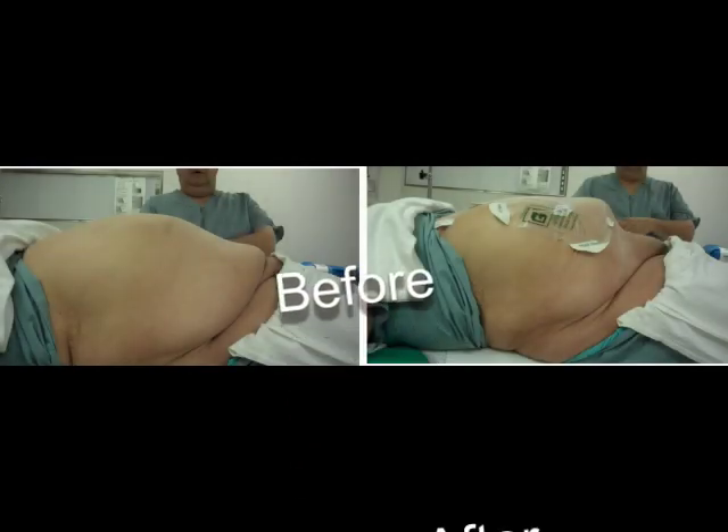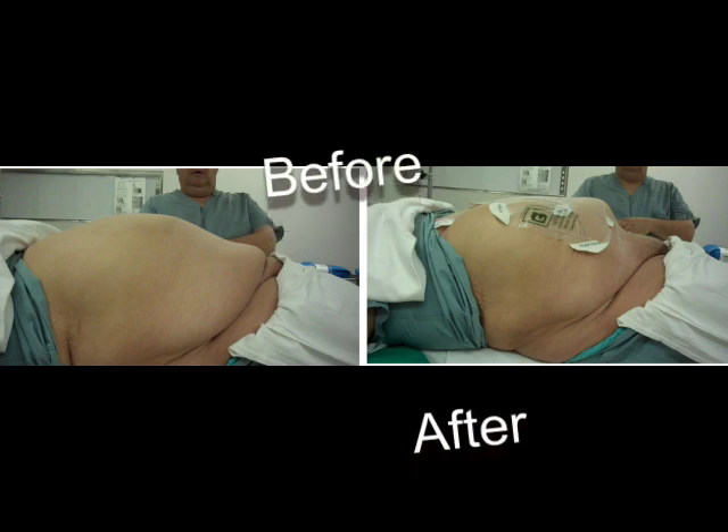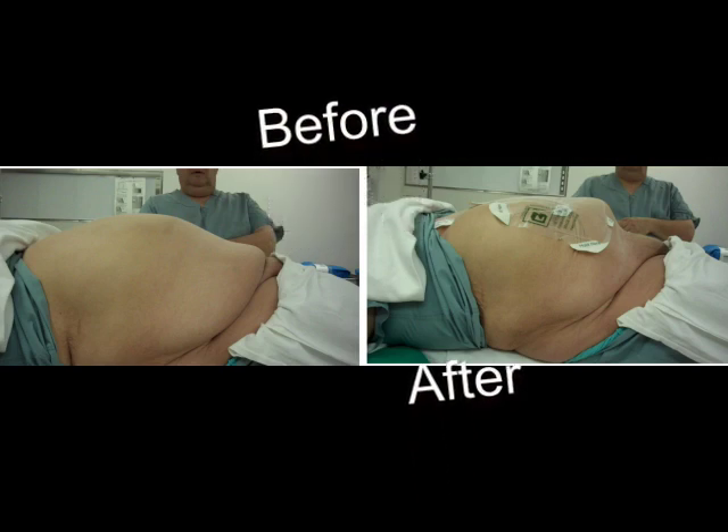It's secure — one that you can have confidence won't slip or release during your procedure — and is very kind and gentle on the skin. Equally important, it is comfortable and does not cause undue embarrassment to your patient.